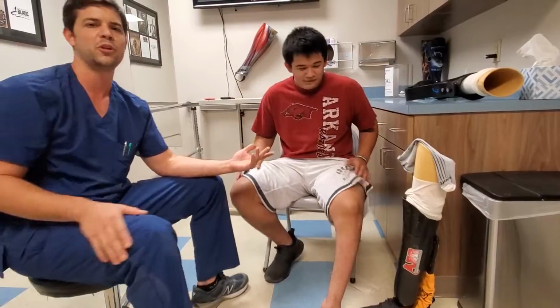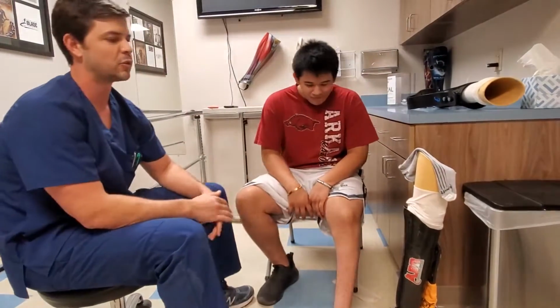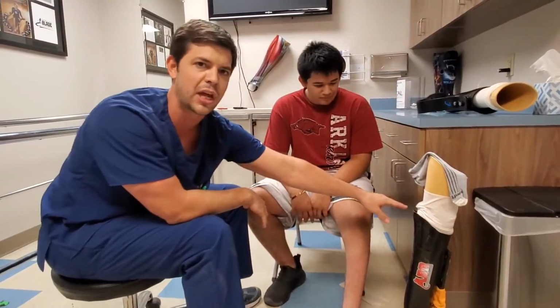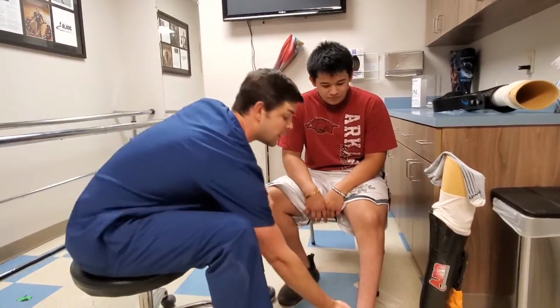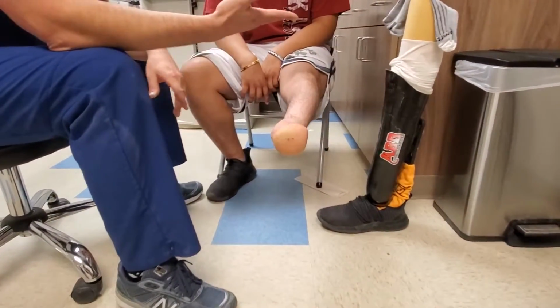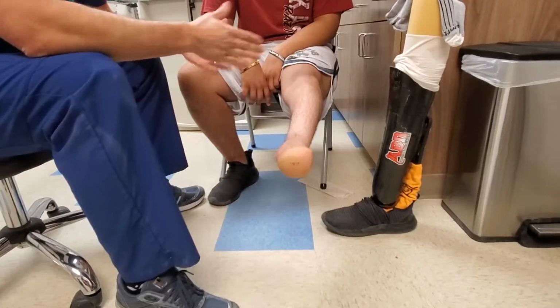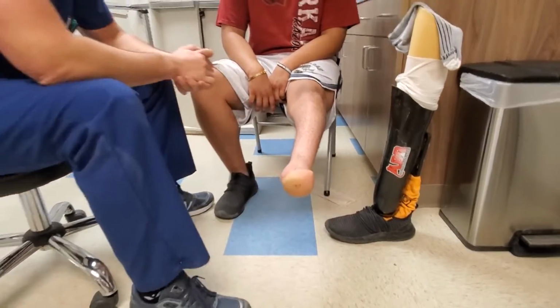Boys meet skeletal maturity around 18 years old. So he's still growing in length and in volume. And so when he came to me, he couldn't even fit in his old socket. It was just super tight. So like I said, the past 3 months, he's been walking around on bare leg here. And so this amputation is really nice because when your leg isn't fitting or you want to shower or get around from point A to point B in the house, you can just walk on his leg.